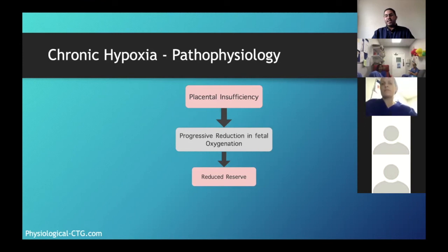But obviously, it was a test. At this point in time, the only time when you do this test anymore is in early labor, late phase, when she comes in contracting, or when you're inducing. She comes in, she's perfectly fine when there's no contractions. The moment she starts contracting, the trace starts showing changes. That's what tells you where reduced reserve is.